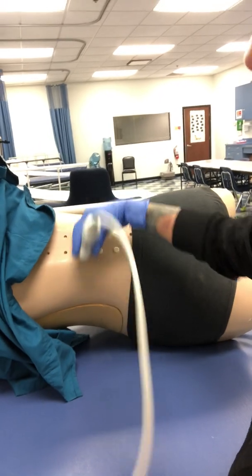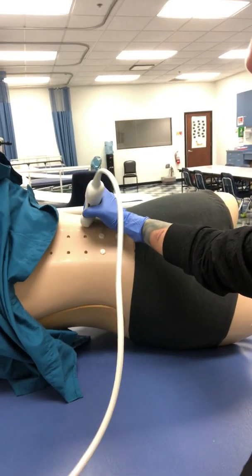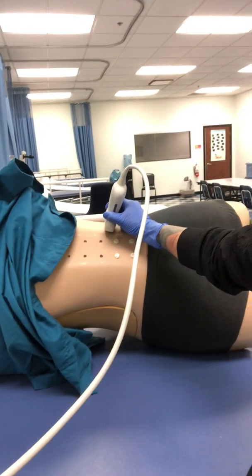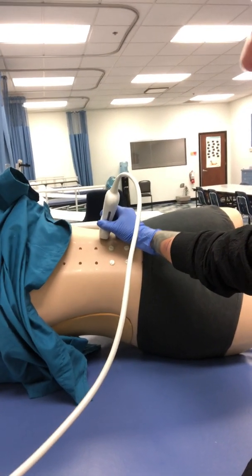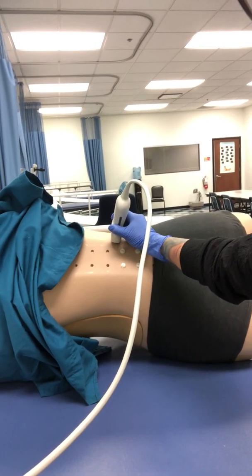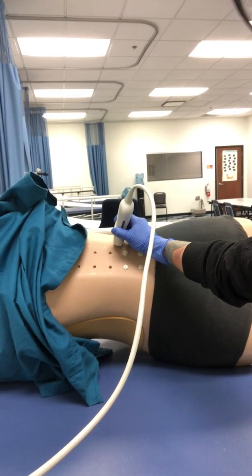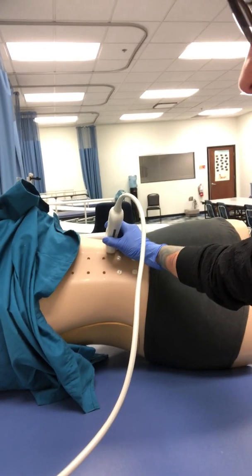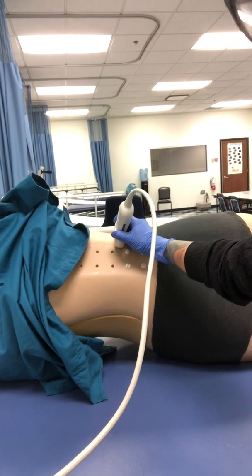And then again, depending on what side you're on, if you turn, the notch is always going to face towards you. So if the patient is lying face down, now the notch will correlate with that patient's left-hand side, and then the opposite side would be true. So you really have to think about the patient's position and see where that notch is pointing on the patient. And then again, think about where you're scanning from and scanning to.